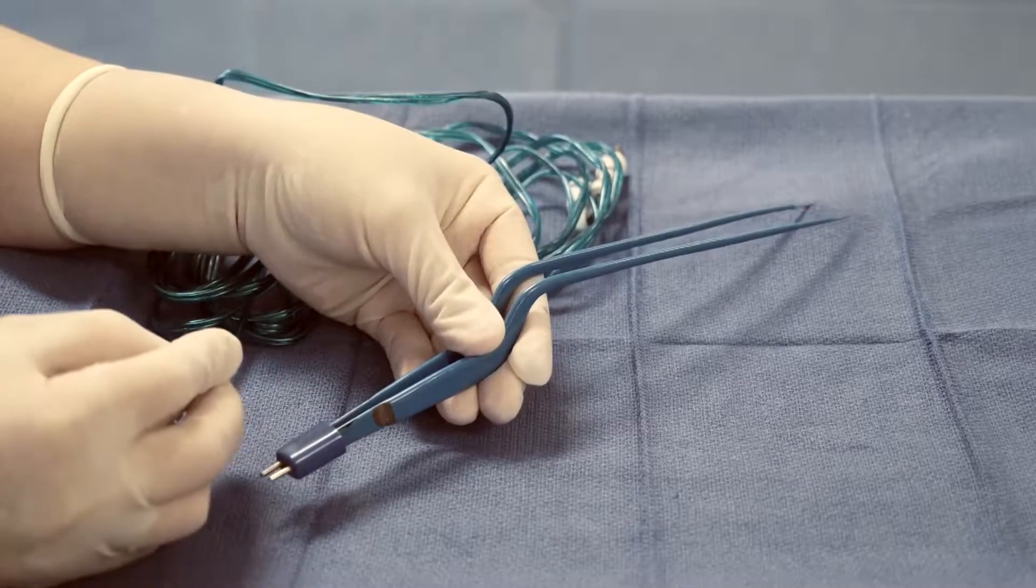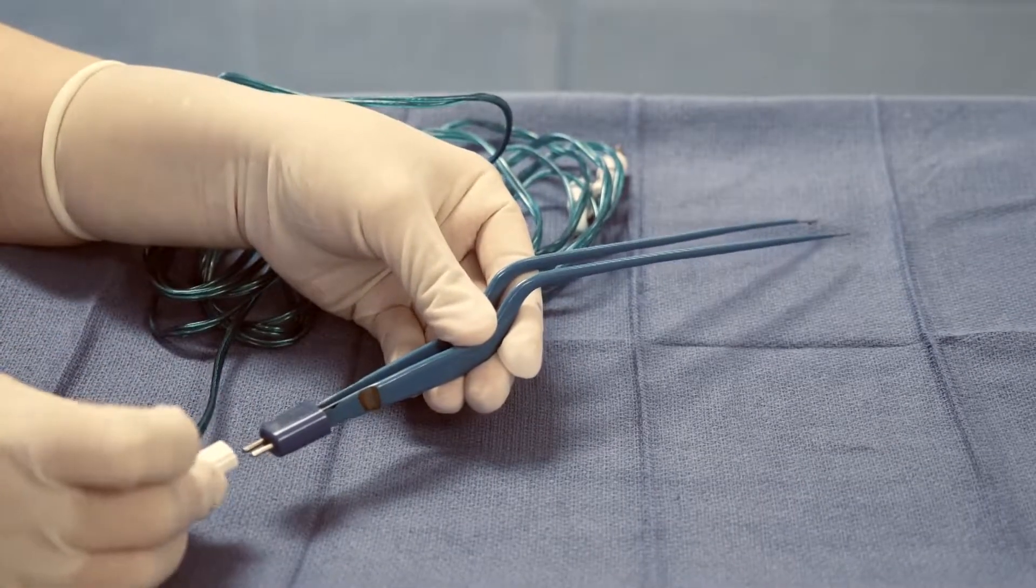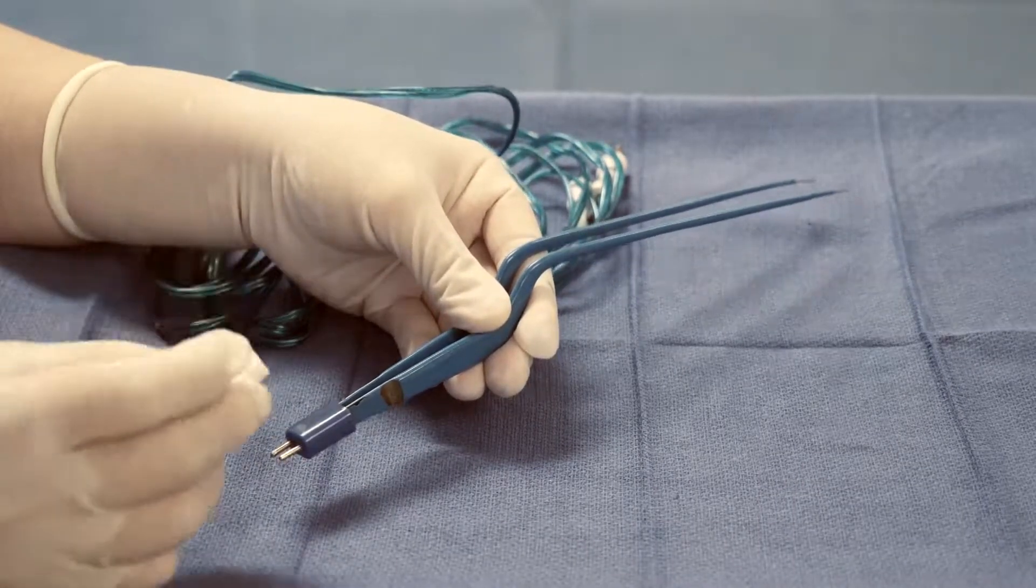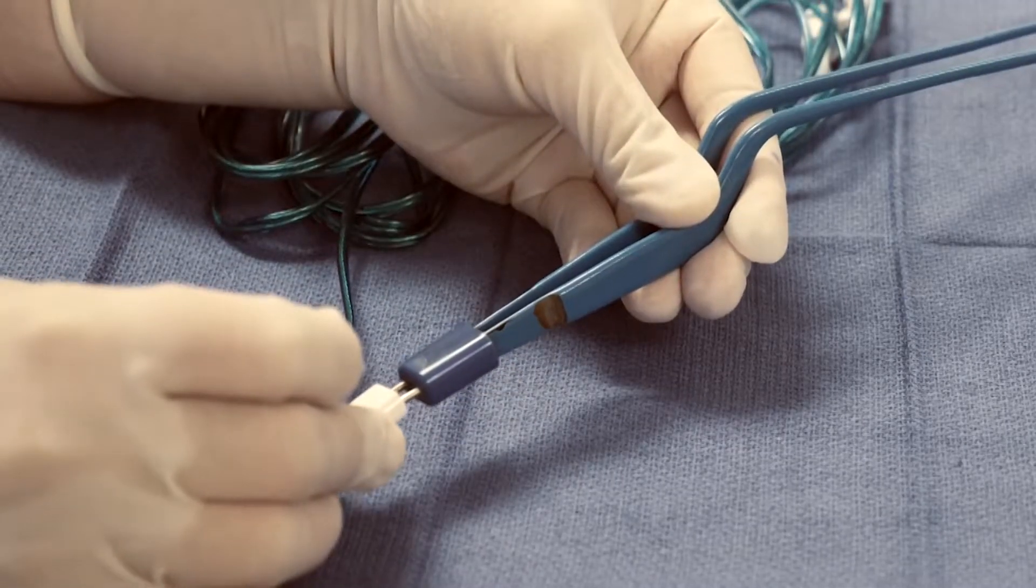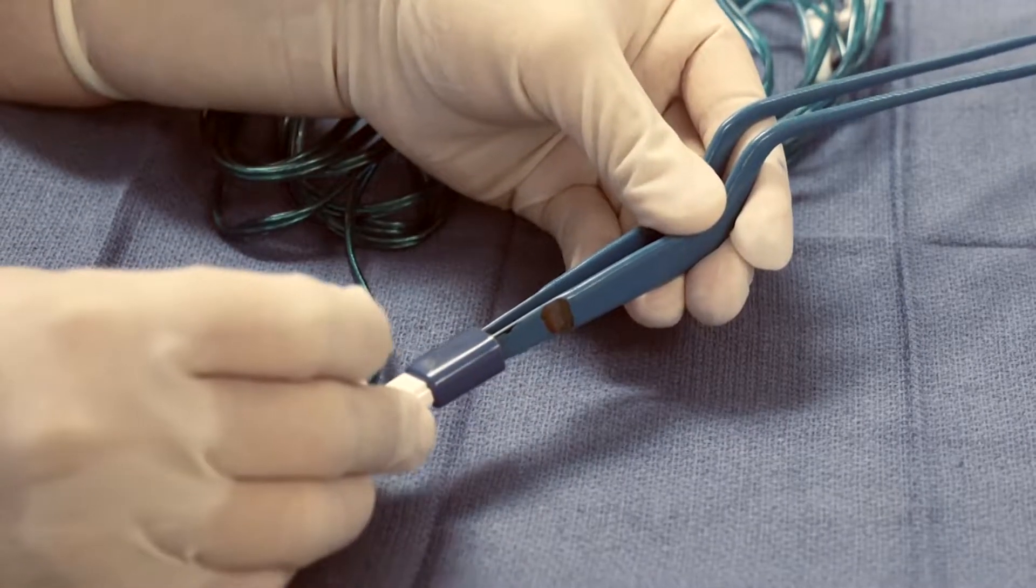The bipolar cord is attached at the tip here. This end will then be passed onto your circulating nurse, which becomes the unsterile part of the cord.